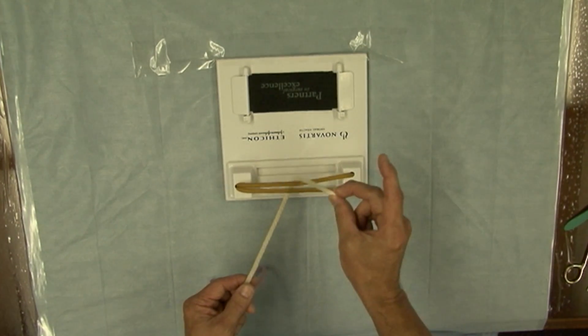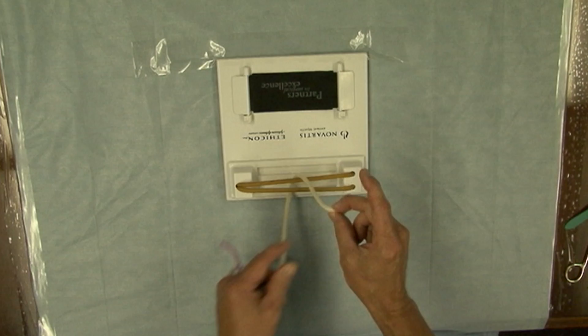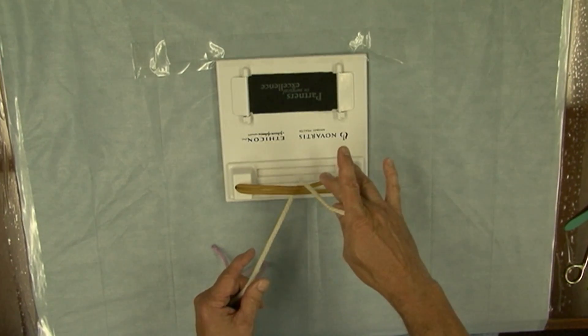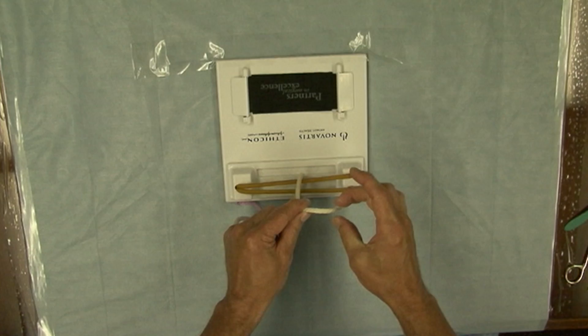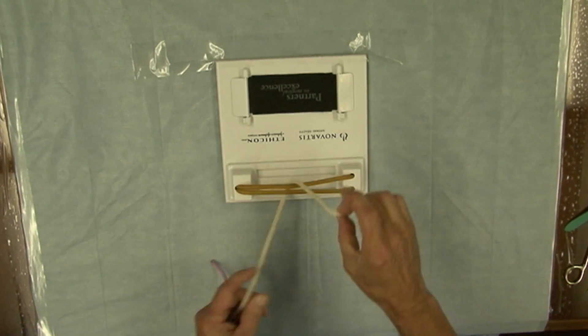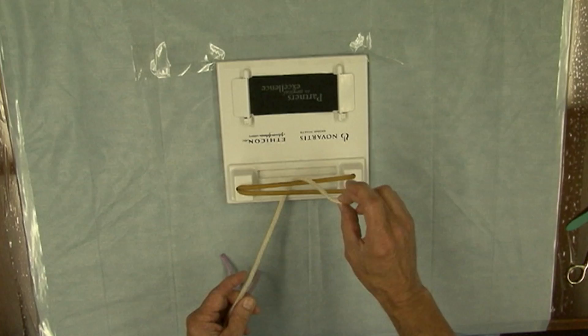It is really important to have the suture material on the tips of your fingers. A common mistake is to have it back like this, and it's really difficult to complete a hand tie with the suture material not at the tips of your fingers.